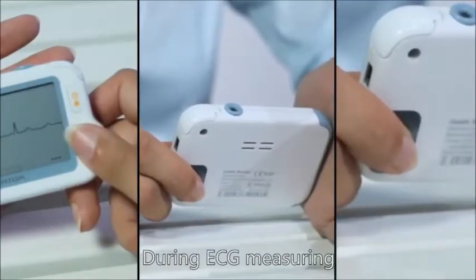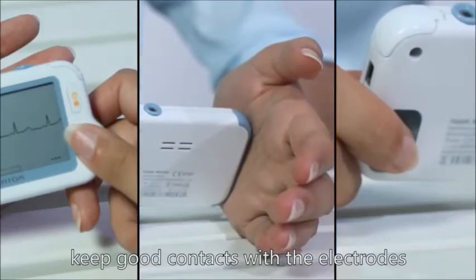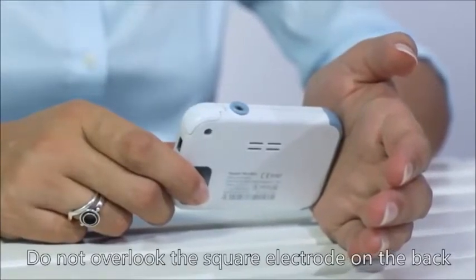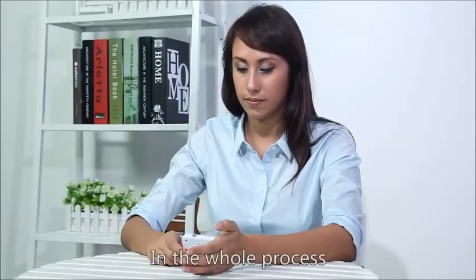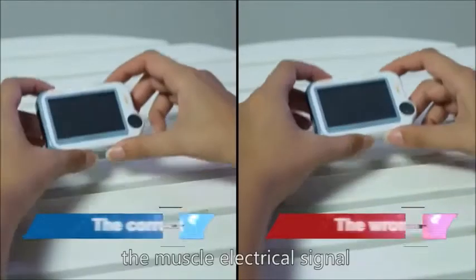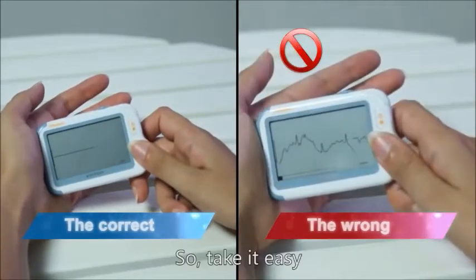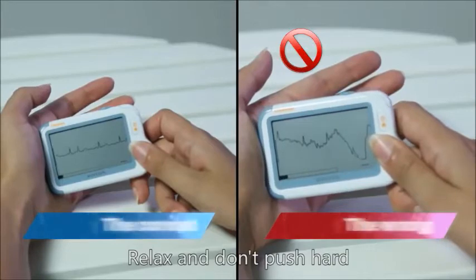During ECG measuring, touch the electrodes gently. Keep good contacts with the electrodes. Keep the two hands away from each other. Do not overlook the square electrode on the back. In the whole process, relax your arms and hands. If your muscle is under stress, the muscle electrical signal will make the ECG waveform noisy. So take it easy. Relax and don't push hard.